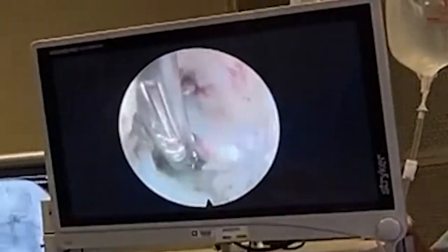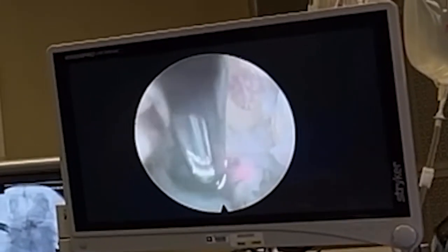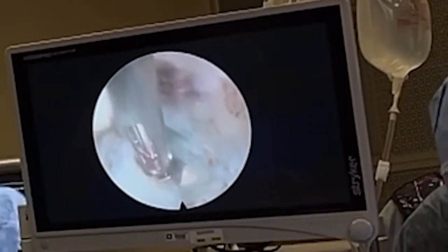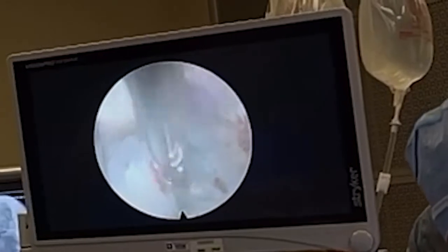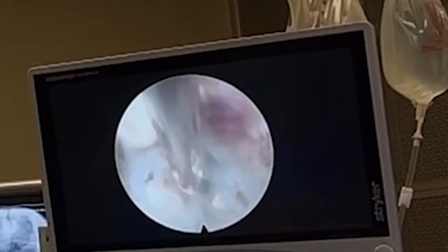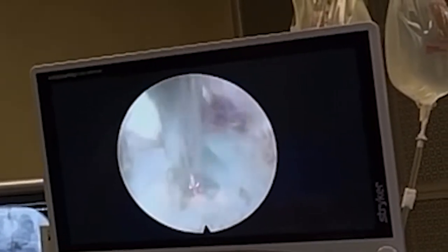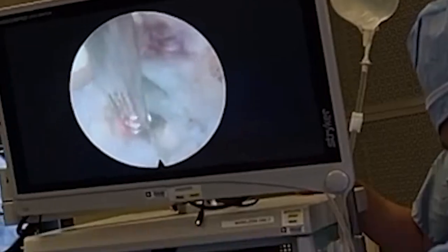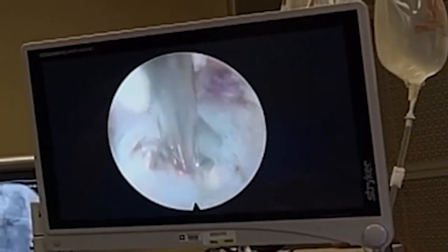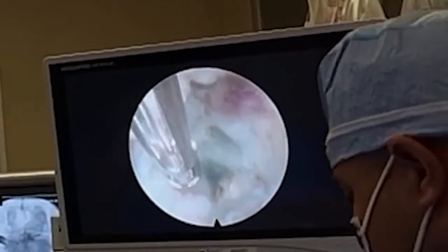There's the laser. The red is just the aiming laser. It's not the actual laser. And I don't know if you can hear it, but there's a little tapping sound, because the laser is a mechanical instrument, not an electrical instrument. How cool is that? So it doesn't conduct. It's like a little mallet, a tiny little mallet, chipping away at this, making it disappear. I hope you're wondering, where do all the pieces go? Why are they magically disappearing? How's that possible? It's possible because it's magic.